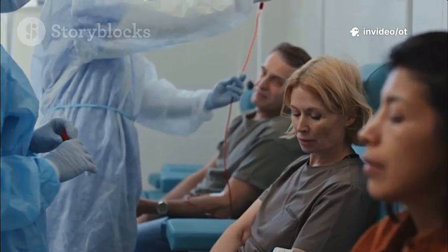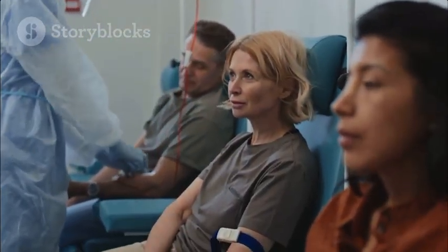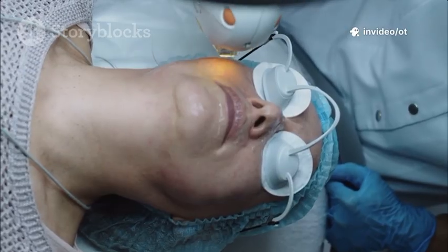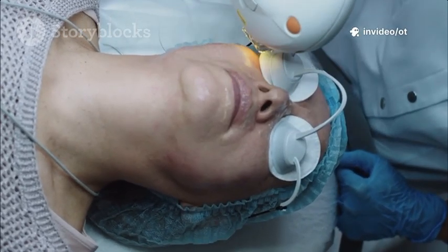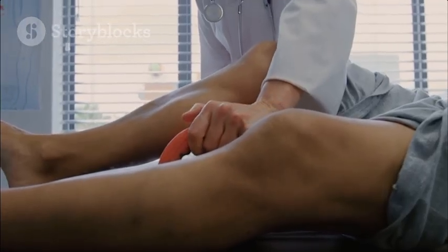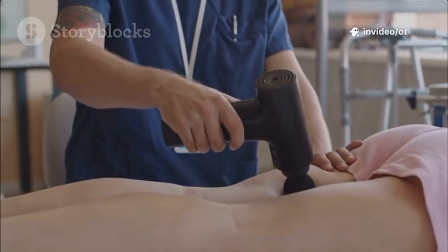Before application, confirm indication. Screen contraindications. Ask about pacemakers, pregnancy, cancer. Verify intact and normal sensation. Inspect skin and circulation. Verify parameters and technique. Always use coupling gel for ultrasound. Monitor continuously. For thermal modalities, check skin at 5 minutes. For E-Stim and ultrasound, maintain verbal check-ins. If adverse signs occur, stop immediately.